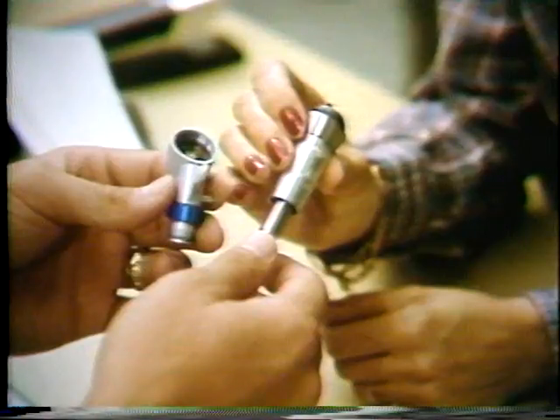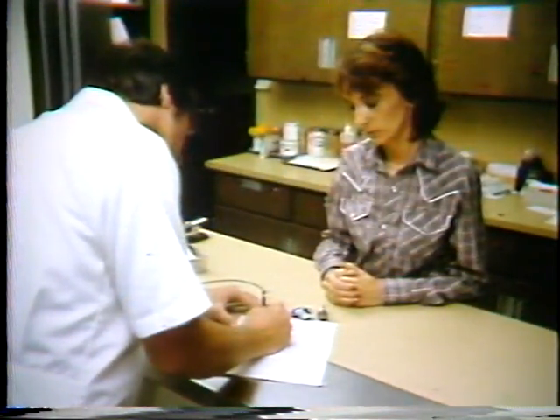3A dispensary. If your handpiece needs to be repaired, the dispensary has loaner handpieces for you to use while yours is being fixed. Be sure to fill out a maintenance slip on your handpiece so that the person repairing it will know what is wrong with it.